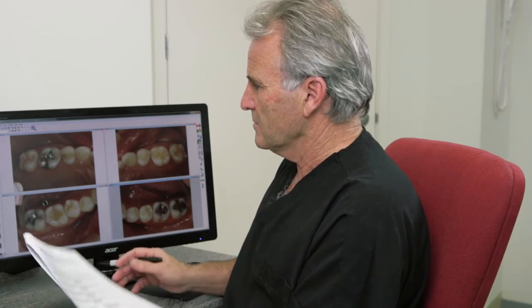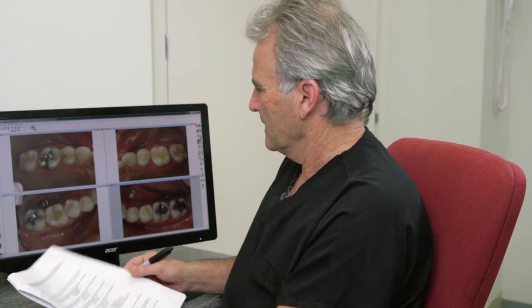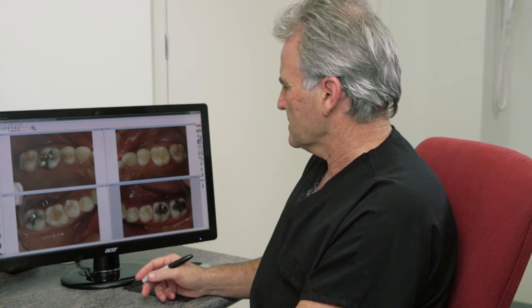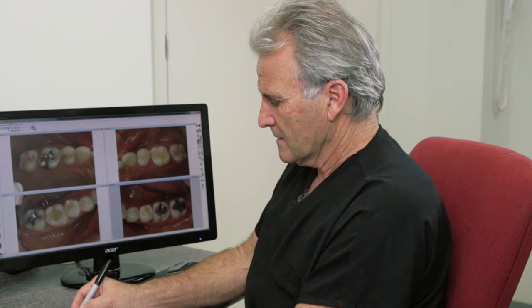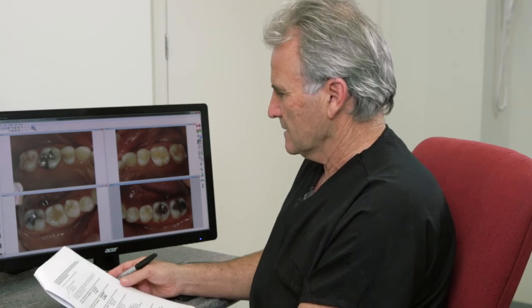So on my upper right hand side, I have one tooth that's potentially rebuilt, and on my back of mouth section I will put one rebuild, one refill and one sealing area, and it's highlighted in my template. I do the same to the left, and I look at these areas here and feel that these are simply filling replacements, and reviewing my x-rays to confirm there's no depth issues there, I put 3 refills and cross out the rebuilds and the sealing.